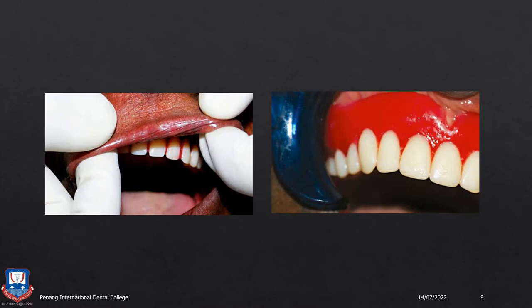Next, we insert the upper denture. We similarly check the upper denture for the peripheral border seals. You should be able to see the mucobuccal reflection. That is, the mucosal fold or reflection from the vestibule should be visible. It should not be that the denture is pushing against the vestibule or sulcus so that you are not able to see the movable and the attached gingiva.